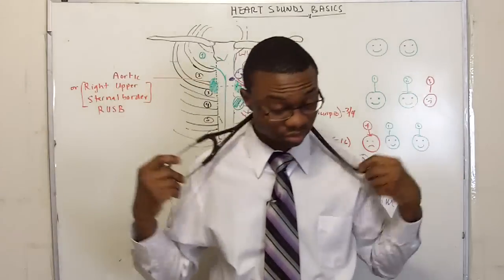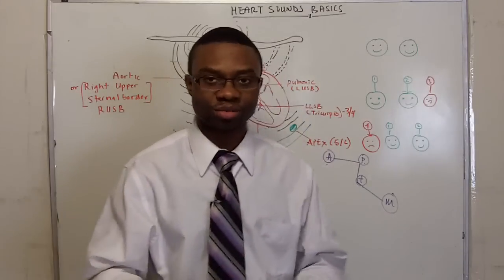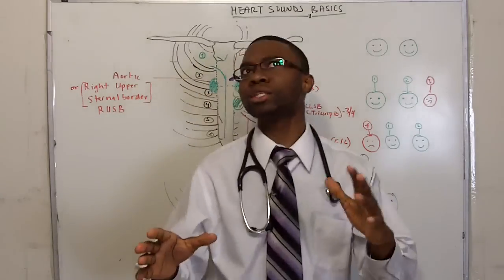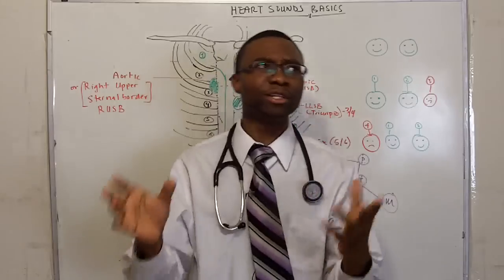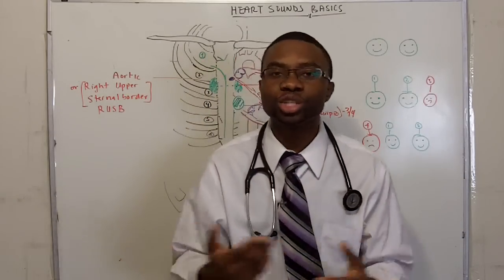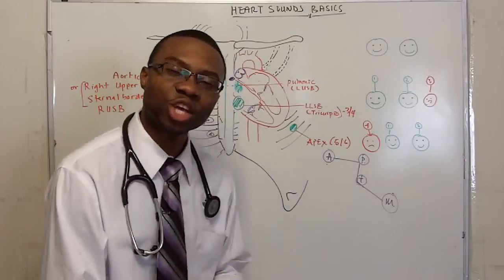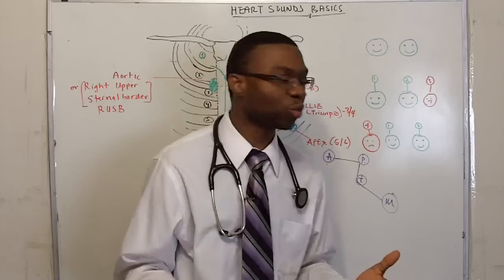Now, we're gonna start with S1, S2. Everybody wants to know, what am I listening to? I wanna know what that is. Is it aortic regurgitation or aortic stenosis? No, don't worry about that. Just know what a normal is. And a normal is what? S1 and S2.